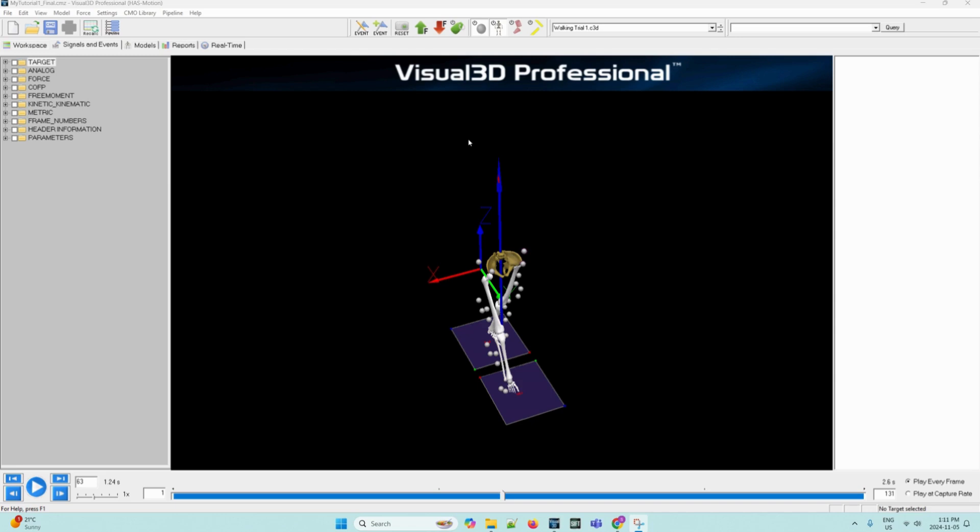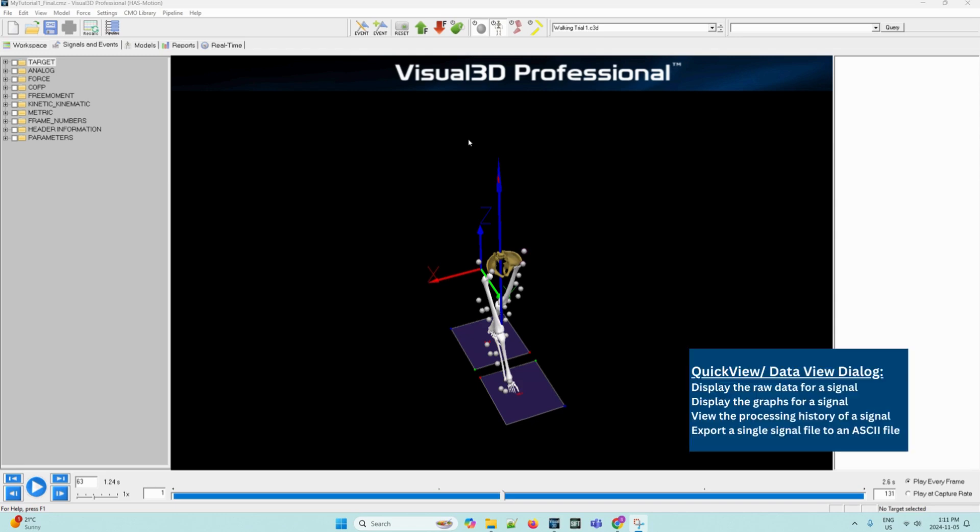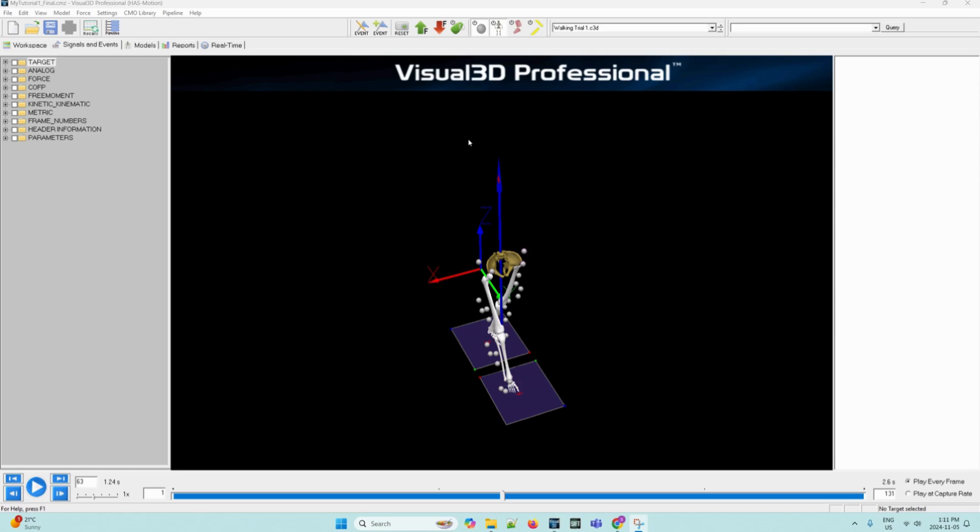Quick view is one of the tools in Visual 3D to help you view your data. You can use it to display the raw data for a signal, display the graph for a signal, view the processing history of a signal and export a single signal file to an ASCII file. To open and use quick view, you must follow the following steps.